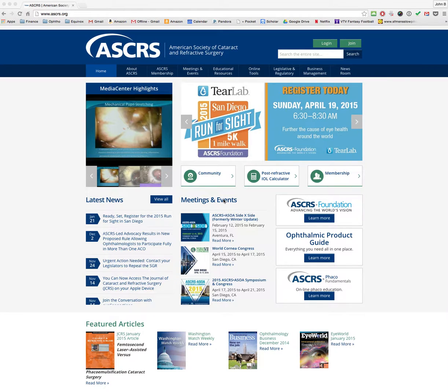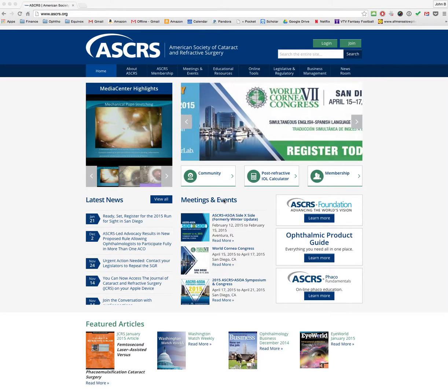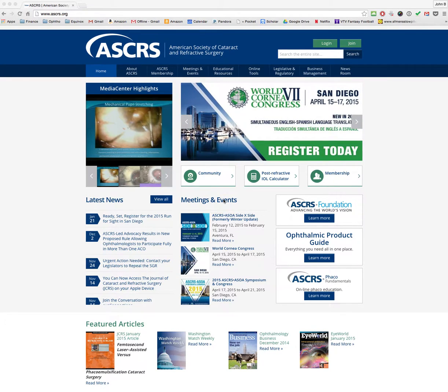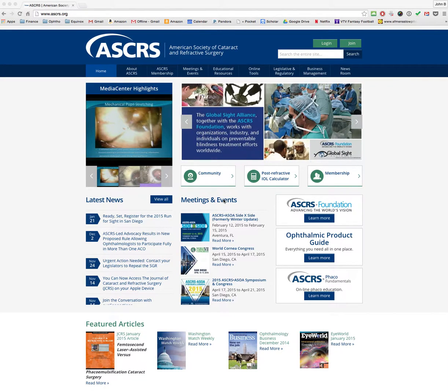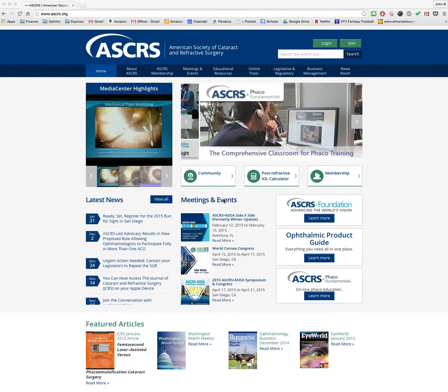This is John Berdahl, and I just wanted to give you a quick tutorial on how to use astigmatismfix.com to help solve the problem of residual refractive error after implanting toric IOLs.